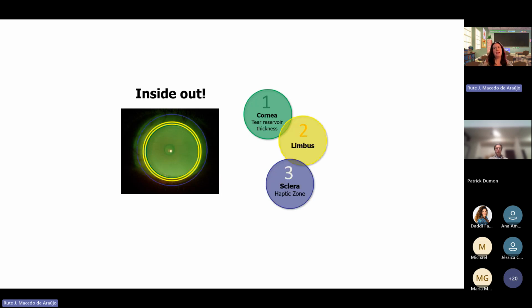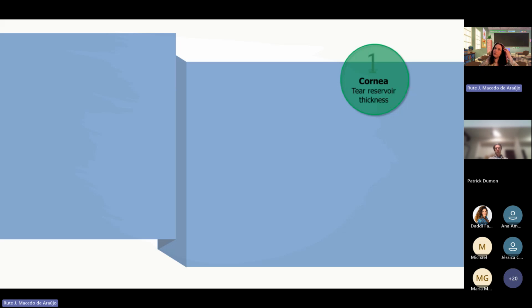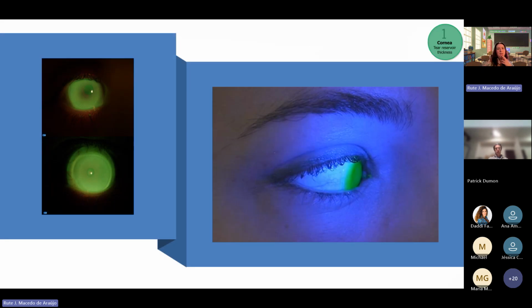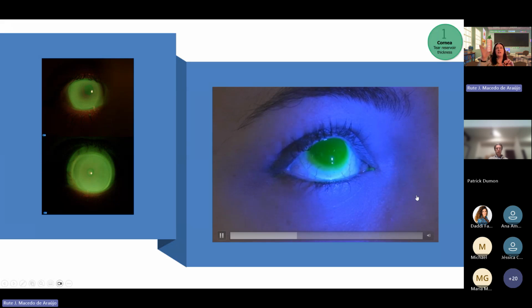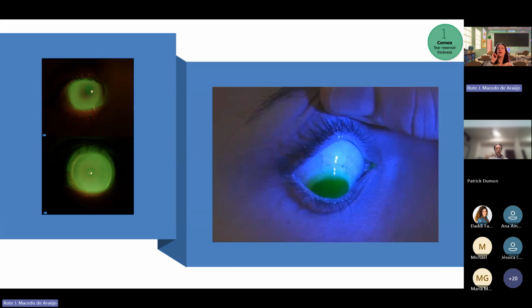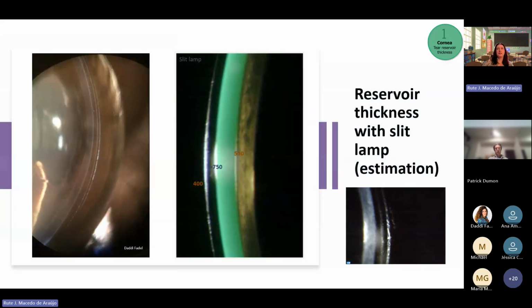So first the cornea, then the limbus, and then the haptic zone. Remember, without evaluating the fitting with advanced technology, we need fluorescein and a slit lamp. It will help us to see if there is any touch in the limbus, any touch on the ocular surface, on the cornea. But we also will need to do an optic section with the slit lamp to estimate the tear reservoir thickness of the lens.